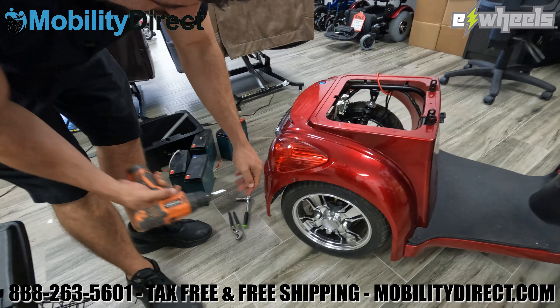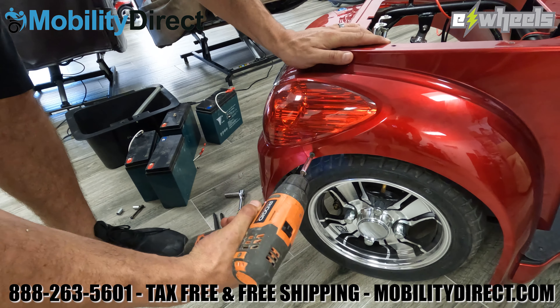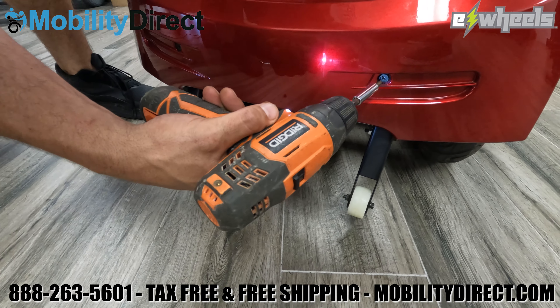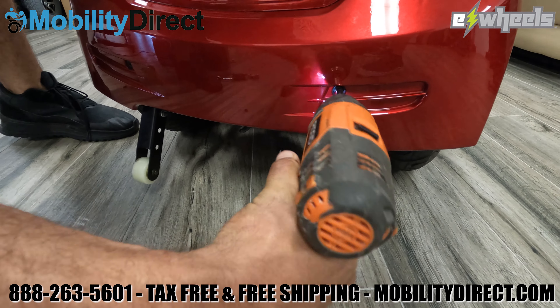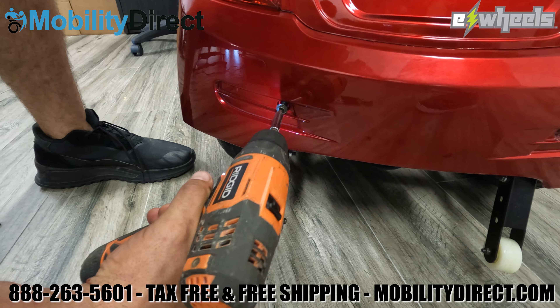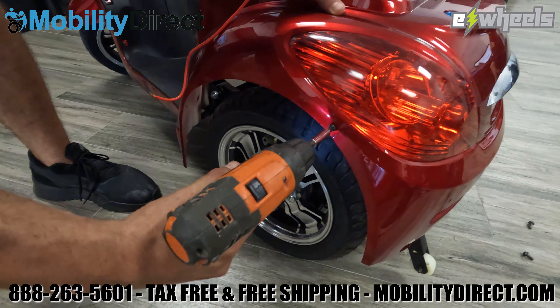Now we're going to remove the rear body panel. There are a set of four screws on the rear side — the first one is on the right side, then two on the rear right above the anti-tip wheels. Make sure you grab those two, and then the fourth screw is on the left side above the left wheel. Lastly, remove that left screw above the left wheel.